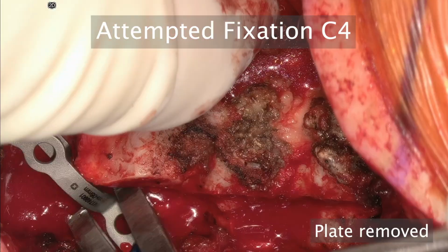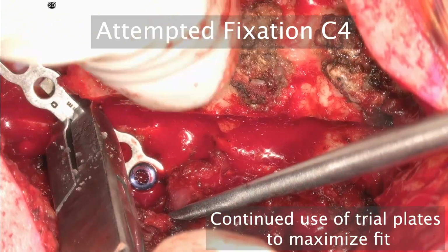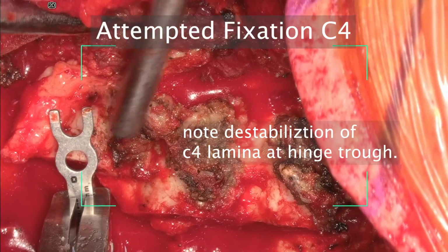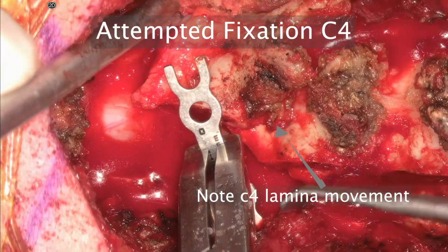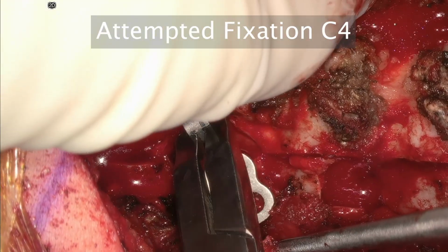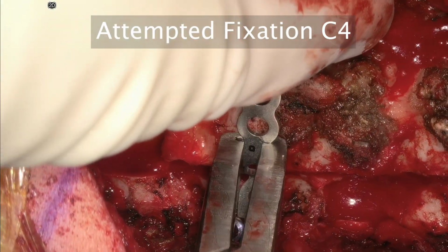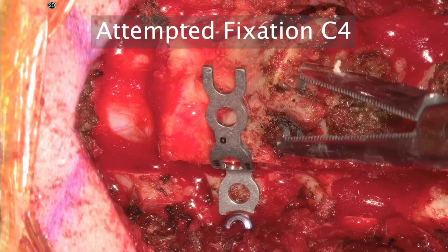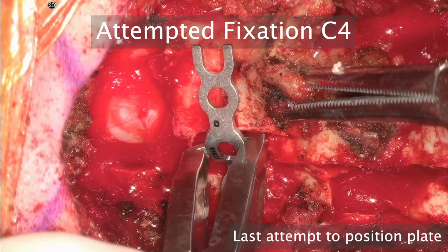Now, despite this decompression, unfortunately, the plates can sometimes be a bit one size fits all, which leads to the feared complication that we will realize here in just a moment: it is possible to completely destabilize that hinge trough. In fact, the green stick fracture becomes a complete fracture, and what was a laminoplasty now becomes a complete laminectomy. Despite trying some different size plates, a plate without a throat, as well as considering a hinge plate, ultimately, what do we decide to do here?